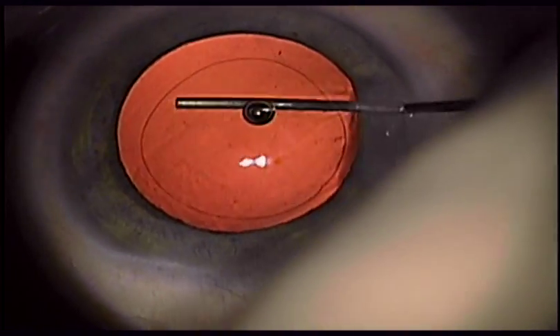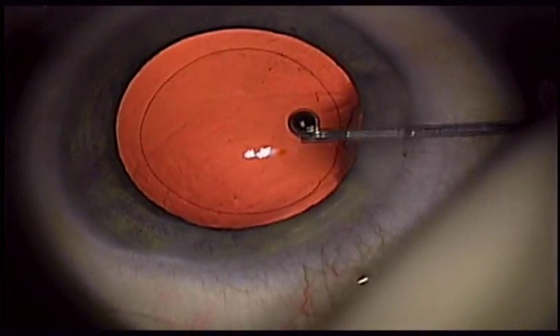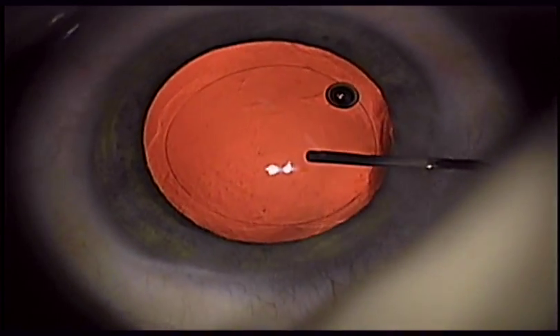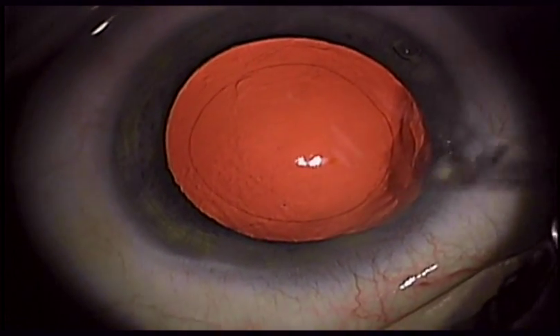It has soft haptics which help to facilitate adjustment of the optic to the patient's visual axis. In addition, there is no matte finish to the posterior surface, and you can easily insert this through a 2.2 to 2.4 millimeter wound.